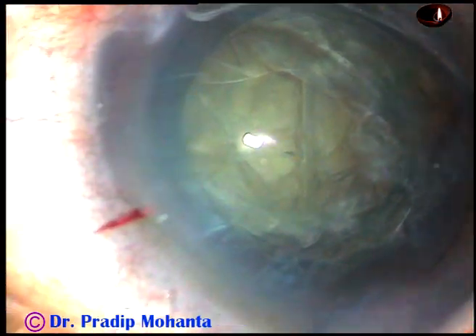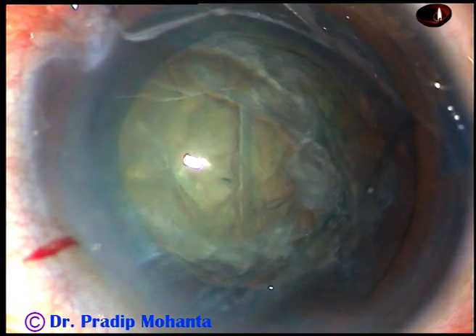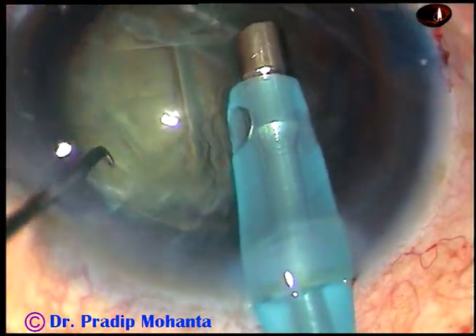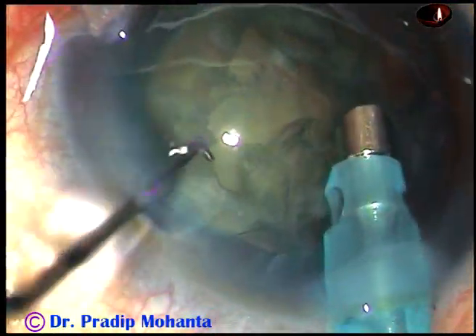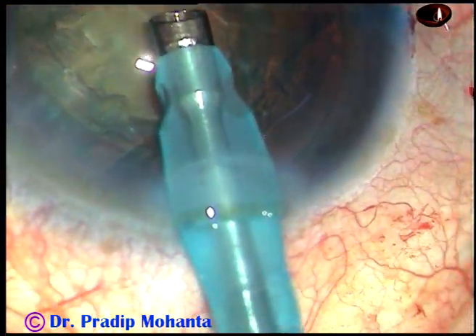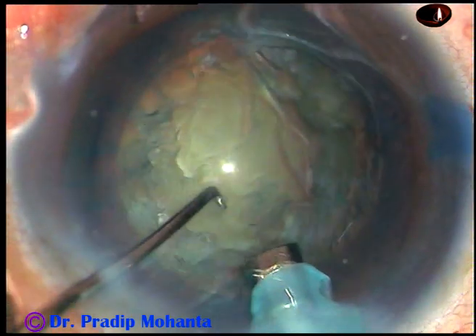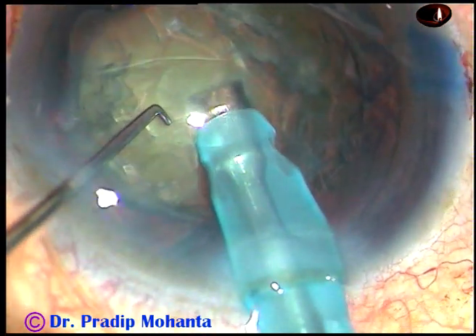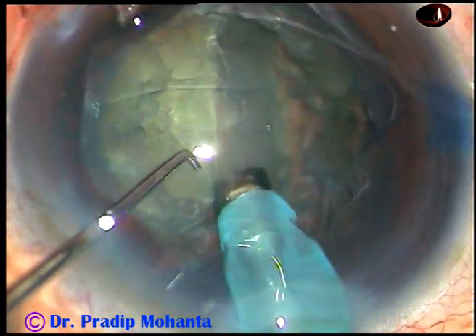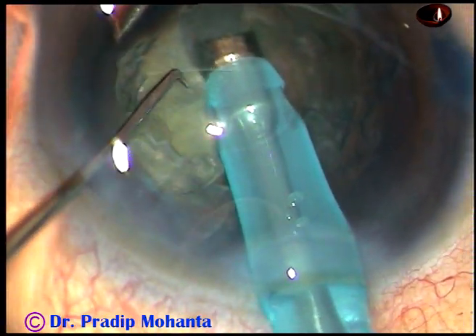Now we are going to introduce the tip of the phaco handpiece. In this case I am going to show the ABC of phacoemulsification — the divide and conquer technique. Go bevel down. You can aspirate some superficial cortical lens matter so that your visibility improves. Now turn the phaco handpiece with your left hand and make it bevel up. Then introduce the chopper. The chopper supports the anterior surface of the nucleus so that the nucleus doesn't tilt. Take care — the eyeball should not turn towards the lower lid. Keep it facing the microscope.